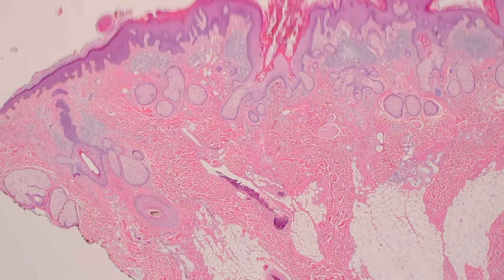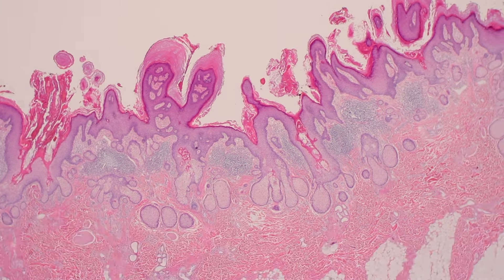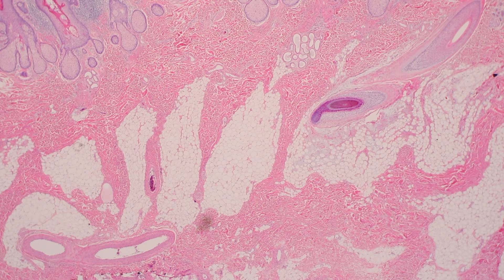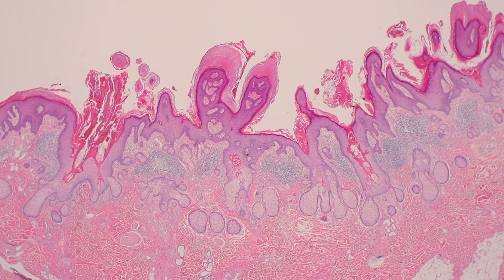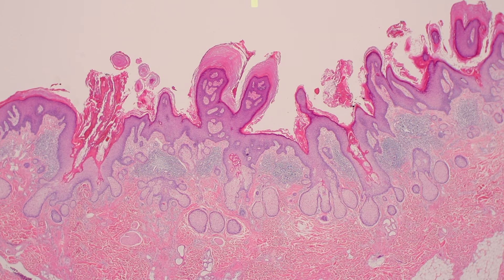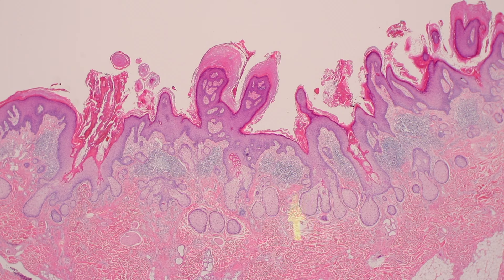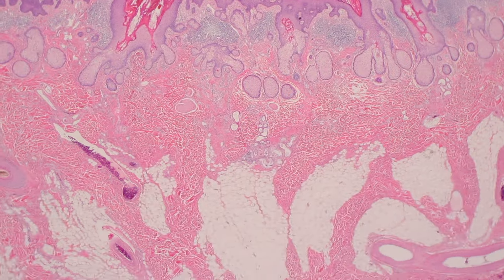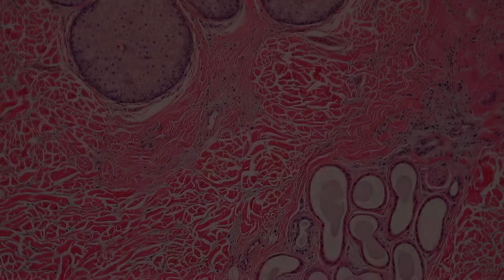From low power, if you're thinking about nevus sebaceous — when they're robust they look very obvious, but on more subtle lesions you might wonder if there's enough to make the diagnosis. Look down below: are the hair follicles gone and you're on the scalp of a child where there should be many? That's an easy clue that you're probably dealing with nevus sebaceous. To summarize: you have papillomatous, acanthotic epithelial surface; large sebaceous glands draining directly to the skin surface; and loss of normal hair follicles underneath most of the time.